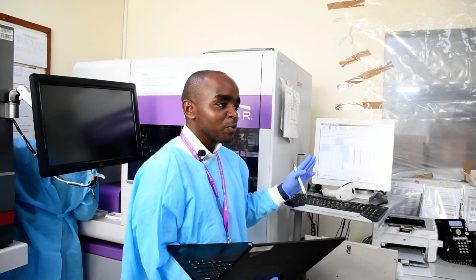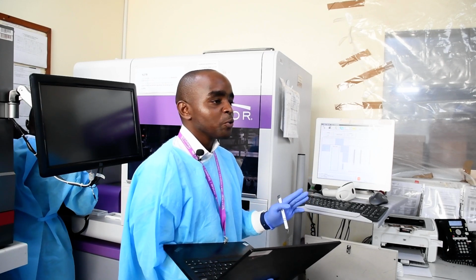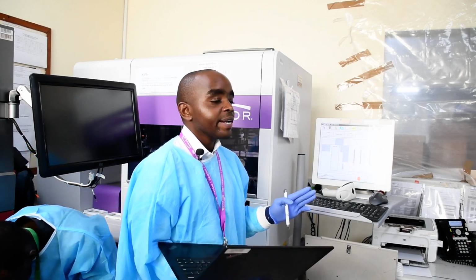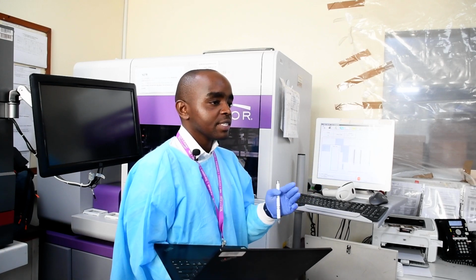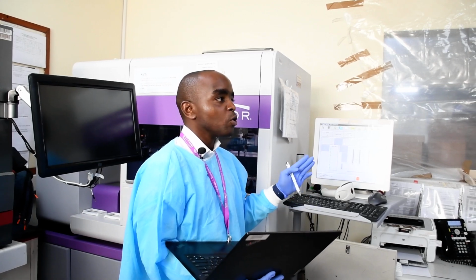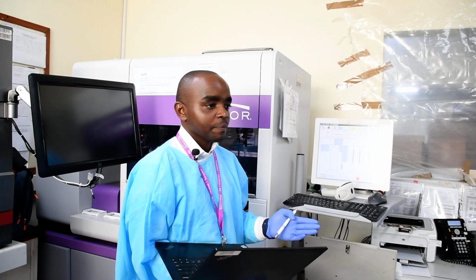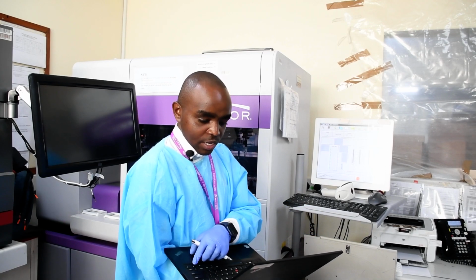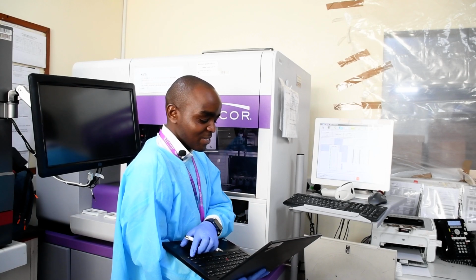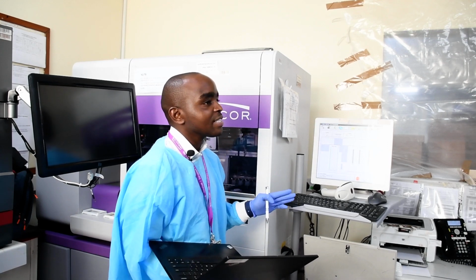Just the blood that is blood group O, because that is where we have the anti-A and anti-B. You don't want any hemolysis, especially when you are transfusing it to non-O blood group recipients, like O to A, or to B, or to AB. So that is critical. For O to O, that one is fine. Now, just trying to summarize all of this: titration is just like a serial dilution.